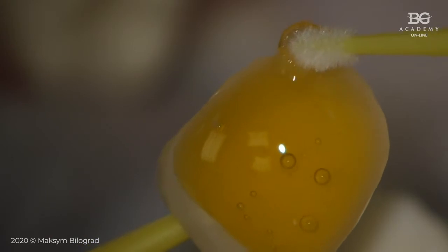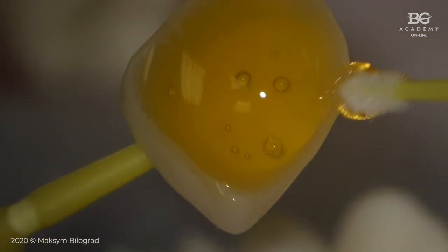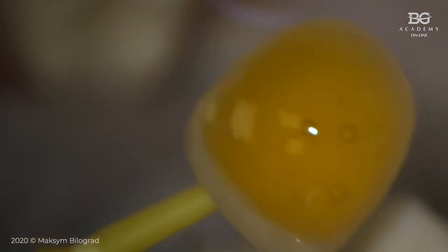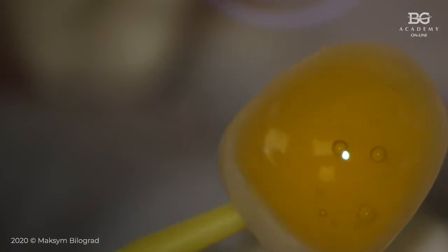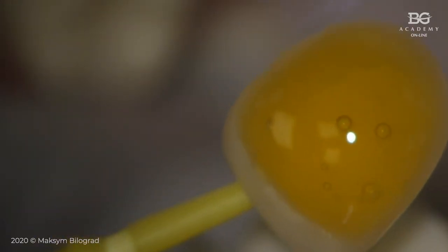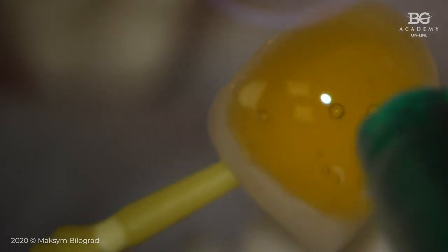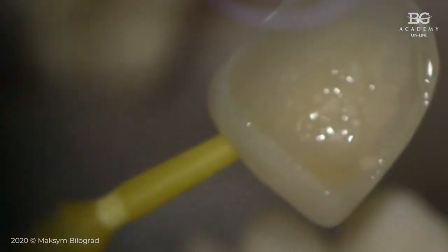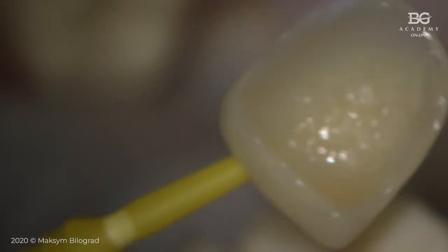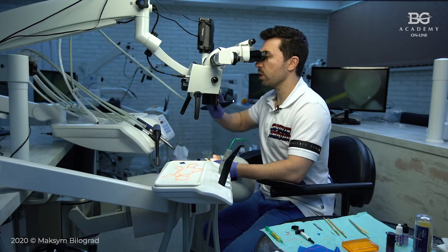This is an extremely important part, to move it to the peripheral area of your veneer, because you have to etch and prepare this area for the bonding process precisely. Okay, then after 20 seconds we will rinse everything.